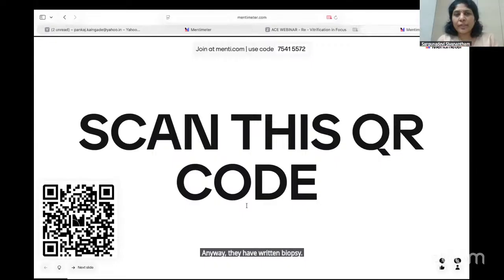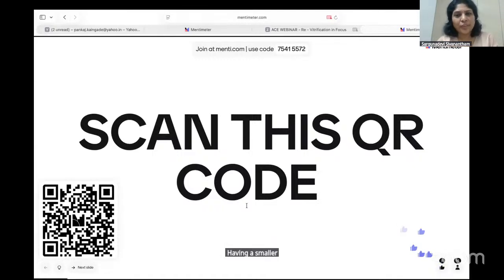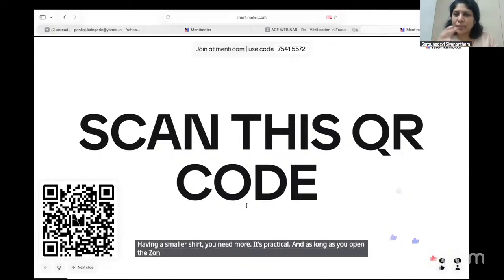Yeah, laser shots, I just go with, not single, it depends on the size. If you're giving a large shot, it is just one. If it's a smaller shot, you need more. It's practical. And as long as you open the zona at one spot, it's more than enough. Not to go too much. That's it. Very precise, thank you.